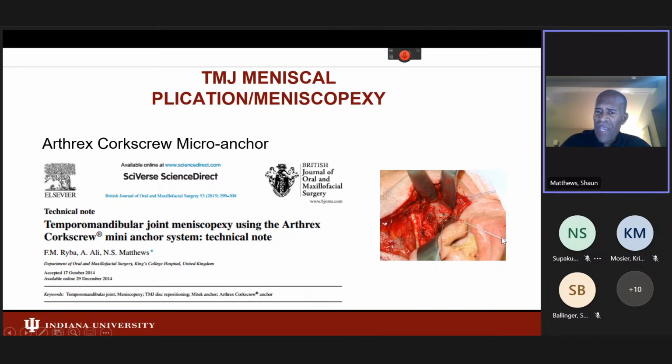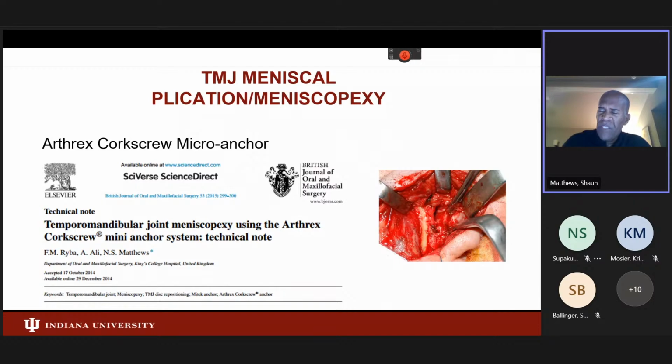At the end of this fibrewire is a small suture needle that we use to pass through the freed up articular disc. So once the disc is mobilized and free, we then pass the needle through the mobilized disc and pull that disc back anatomically over the head of the condyle to where it should be correctly sited. So this is the mobilized disc shown here in this image.